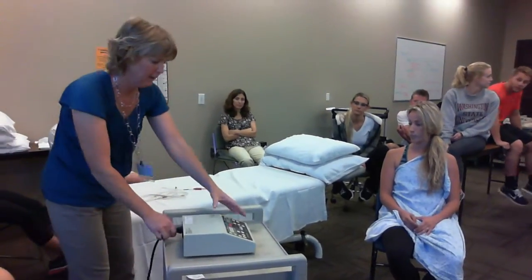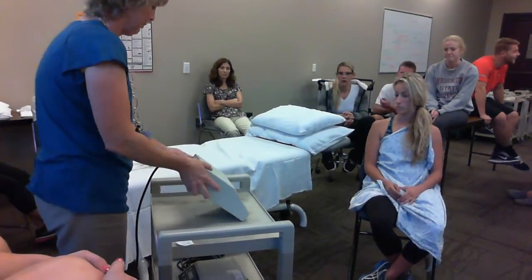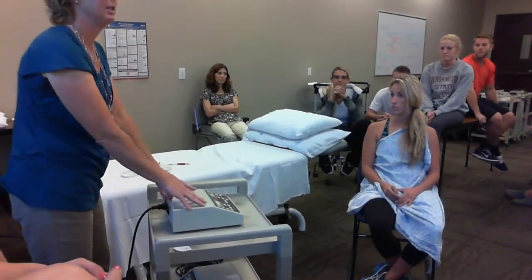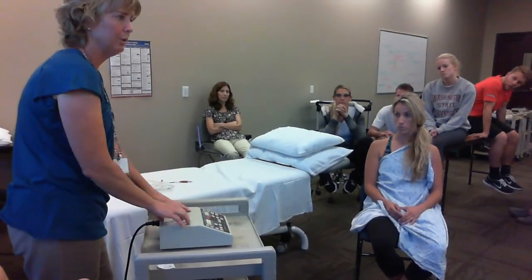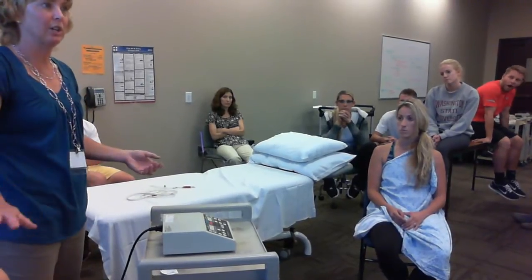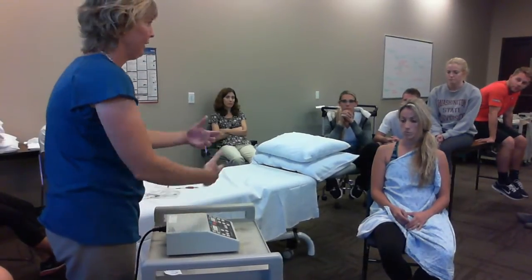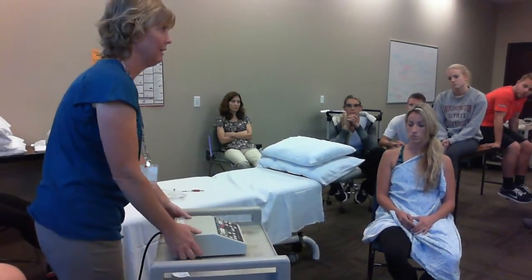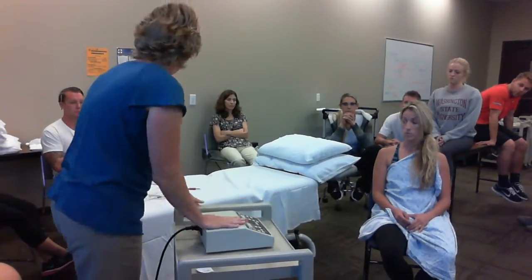For the machine itself, you need to get used to this: after you plug it in, the first thing you're always going to do is turn your machine on before you do anything else. You don't hook the electrodes up until the machine is on, and the reason for that is safety again. The machine can hold a little bit of charge. I rub my foot, I'm holding charge, I touch someone, they get a little shock. If I hook her all up and then turn the machine on, she can get a little bit of a shock. So as a safety, anytime you plug in a machine, turn it on before anything's attached to your patient. Okay. All right.